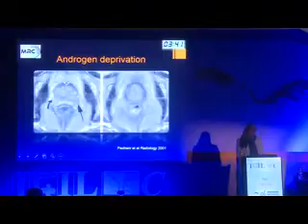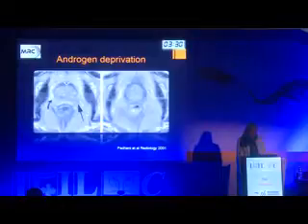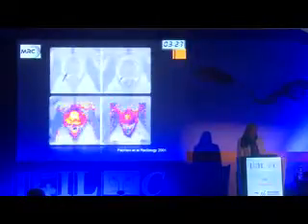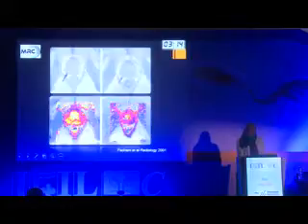This is a mass, and this is before therapy. But notice the prostate shows completely heterogeneous signal, including even the area which had no mass in the previous therapy setting. But we can rely on the dynamic study to assess if there is a residual tumor or a complete response. As noticed here, this is hypervascularity located in another patient on the right aspect of the gland. And notice after the treatment, there is no vascularity, indicative that this is a complete responder patient.